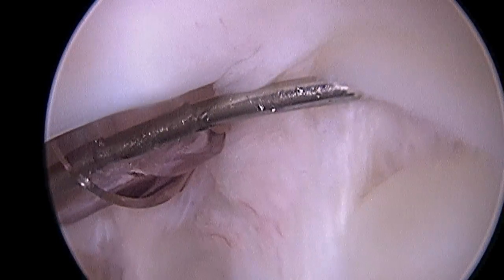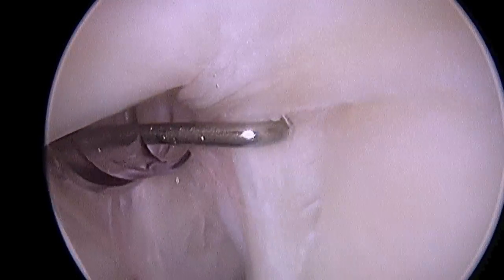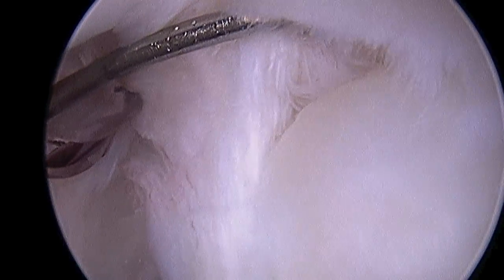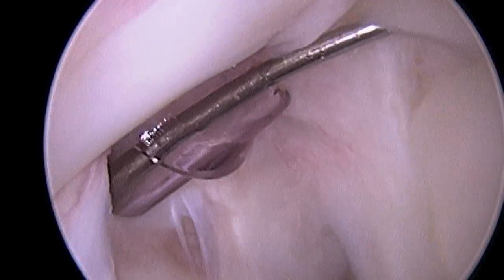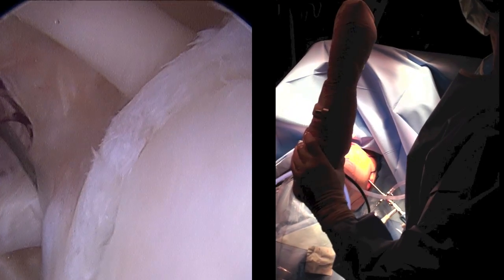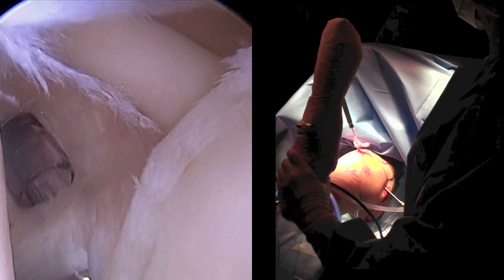Here we are at surgery. I've established an anterior portal and now I'm probing the superior labrum. You can see how the biceps has been detached from the glenoid or cup of the shoulder. Now here we can really see that peel-back mechanism. You see as I externally rotate the shoulder as if the patient were throwing, the superior labral complex is pulled away from bone as the biceps applies traction to it. Let's look at that in full screen mode.